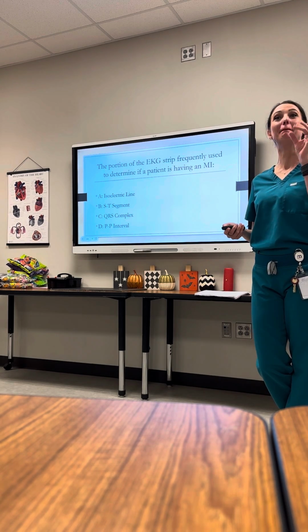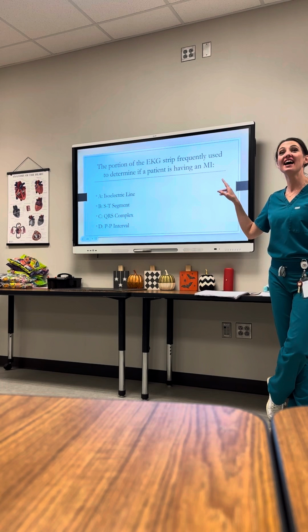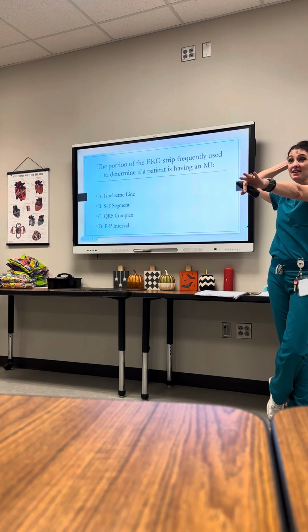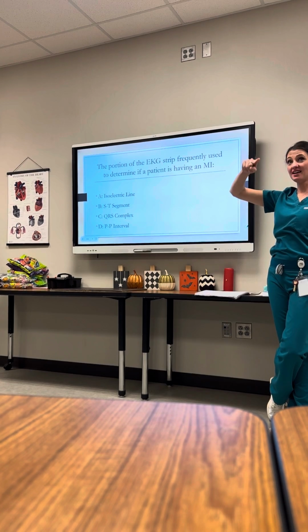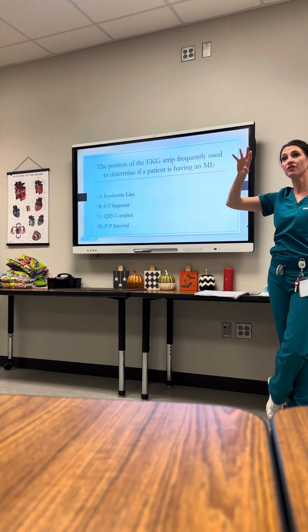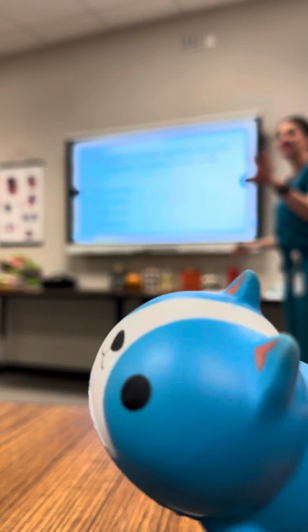Correct answer is B, as in boy, all right? So the ST segment, remember, what do I call it? Yeah, a STEMI. Remember, if it's that ST elevated tombstone look, and it can look funky. It can look different. You're gonna get some practice at looking at different versions. All right, here we go.